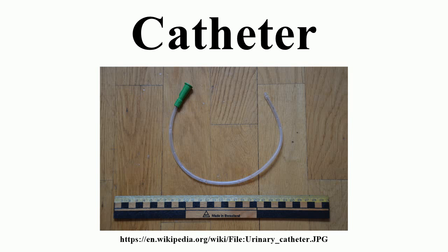There are many different types of catheters for bladder problems. A typical modern intermittent catheter is made from polyurethane and comes in different lengths and sizes for men, women and children. The most advanced catheters have a thin hydrophilic surface coating. When immersed in water, this coating swells to a smooth, slippery film, making the catheter safer and more comfortable to insert. Some catheters are packed in a sterile saline solution. Interventional procedures. Different catheter tips can be used to guide the catheter into the target vessel. Refer for a picture of different catheter tips and their respective names.